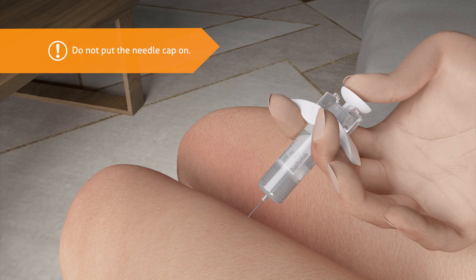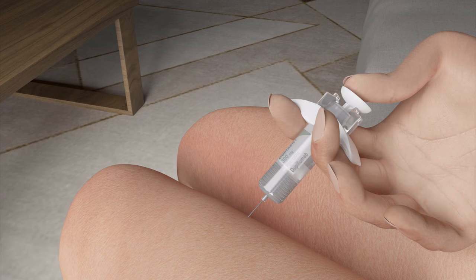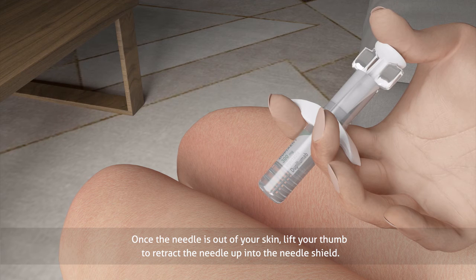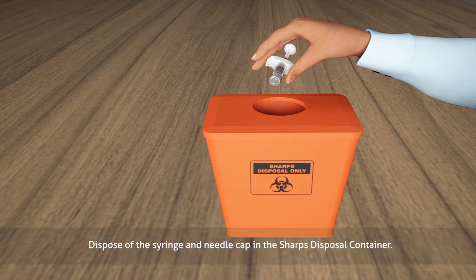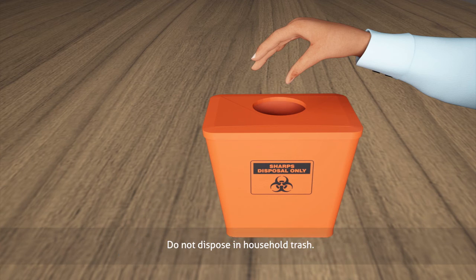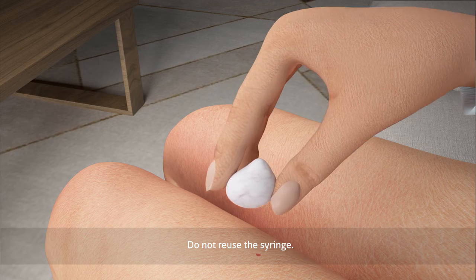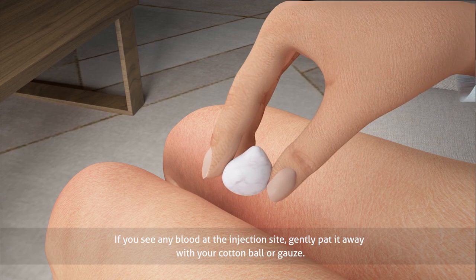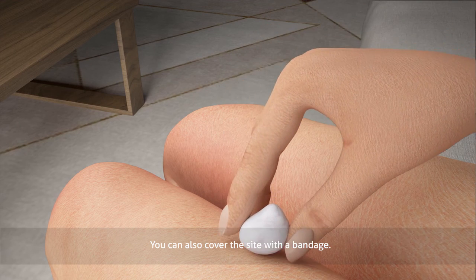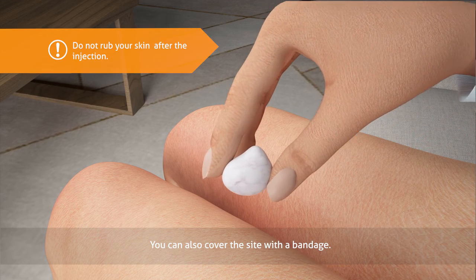Do not put the needle cap back on. Once the needle is out of your skin, lift your thumb to retract the needle up into the needle shield. Dispose of the syringe and needle cap in the sharps disposal container. Follow your local guidelines and ask your healthcare provider for the appropriate way to dispose of the container once it is full. Do not dispose in household trash. Do not reuse the syringe. If you see any blood at the injection site, gently pat it away with your cotton ball or gauze. You can also cover the site with a bandage. Do not rub your skin after the injection.